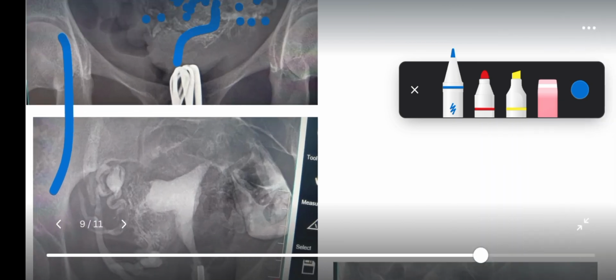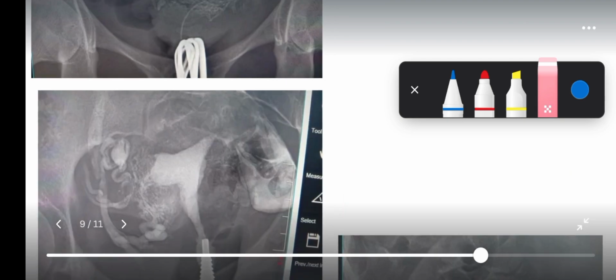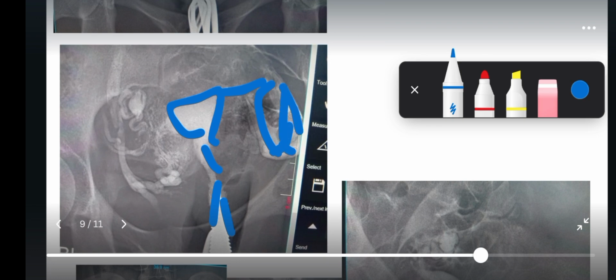We see this other case here. This one here. This is the cannula we used to introduce the contrast. This is the cervix. Then this is the womb. We can make out some tiny things that come out of here and they flow out of the tube. That tiny thing is the tube. This is the flow out of the tube. Spillage. That means there is a free flow.